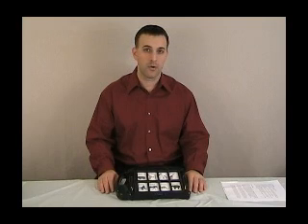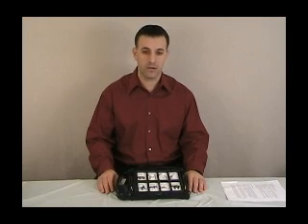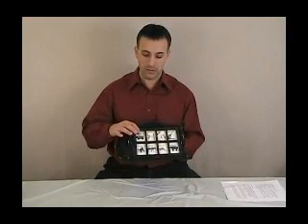So the most important thing to do is, if your machine starts to do that, the first thing you should do is replace the batteries with a brand new set of alkaline batteries. Do not use any type of heavy duty, rechargeable, or any other type of battery. Just use a good brand alkaline battery. And I'll just show you an example of what would happen if the machine was running on weak batteries.